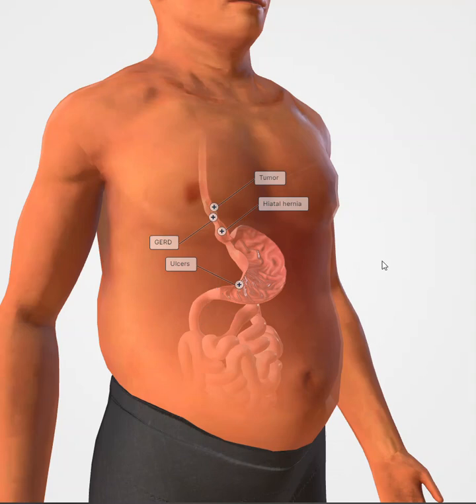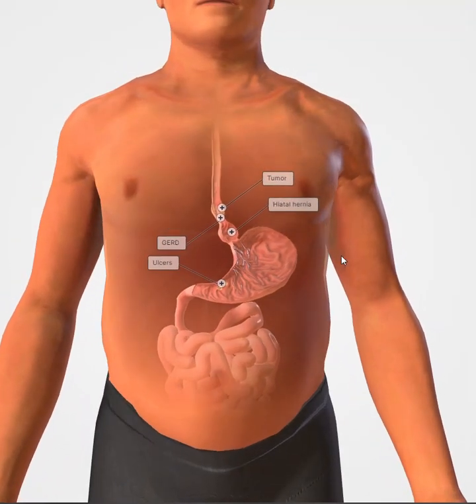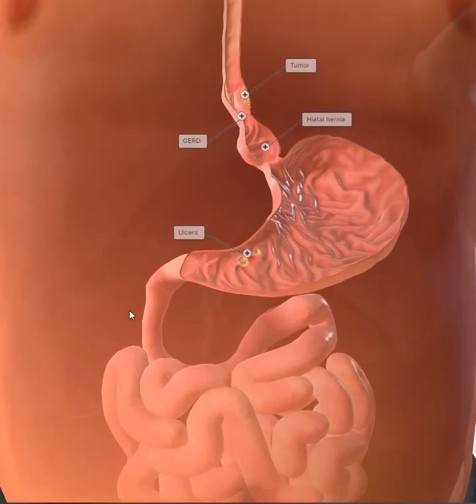So I'm going to turn him back AP very slowly. All right, so we can get just a view. Here's his stomach, AP. It dips posteriorly a little bit more, more on some people than other people, but there's a little superimposition happening here where the duodenal bulb is right after the pylorus of the stomach, all right? So it's shaded a little bit lighter in color, where the duodenal bulb is. So here we go, I'm going to rotate him into LPO position.